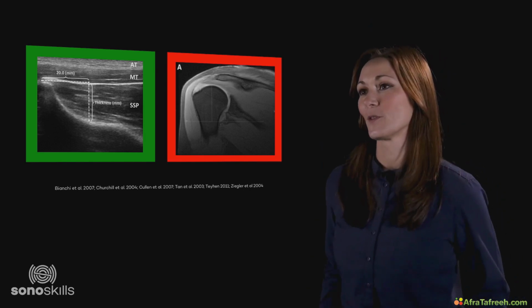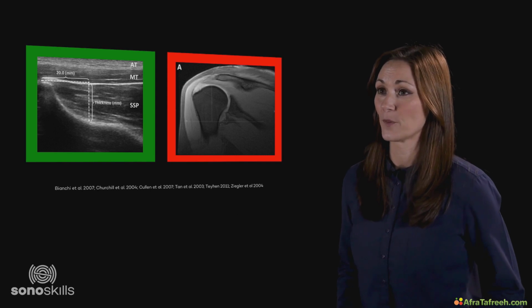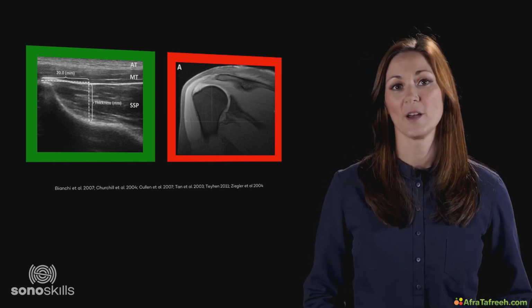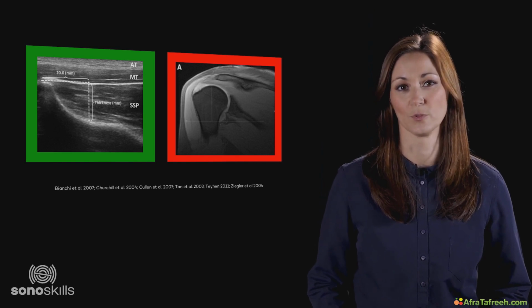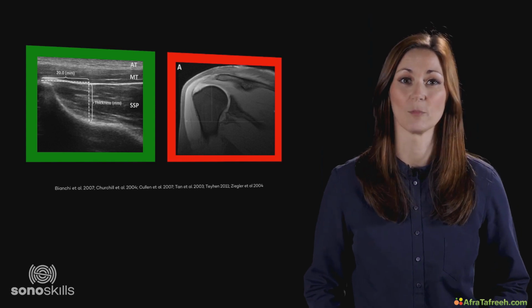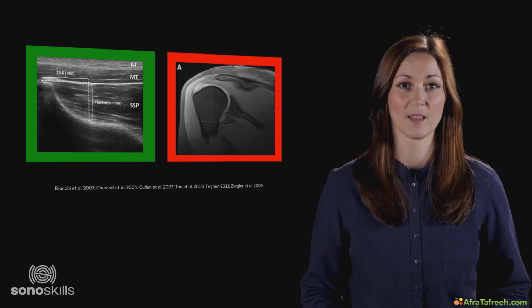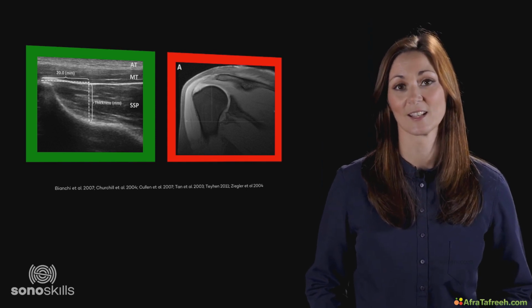The most important advantage of ultrasound compared to MRI is the possibility to make functional real-time scans. Combine the clinical examination with the musculoskeletal ultrasound as much as possible, and see what actually happens with the soft anatomical tissues during movements and provocations. This very functional assessment improves diagnostic accuracy and clinical relevance.